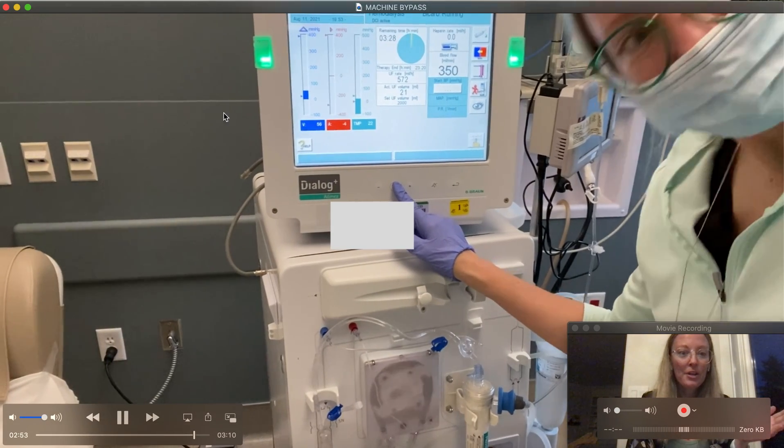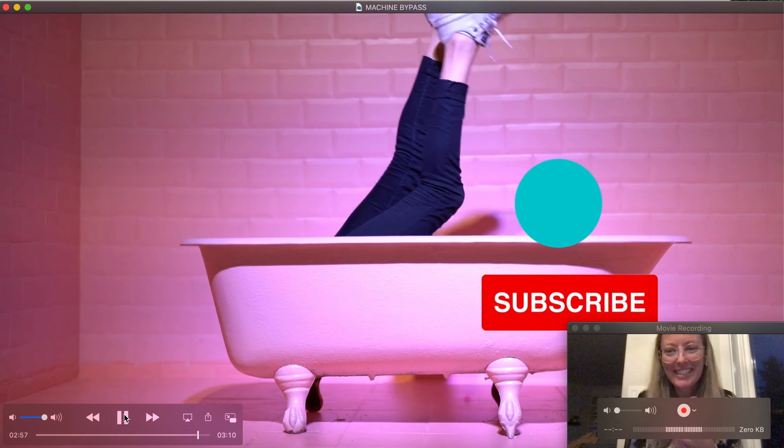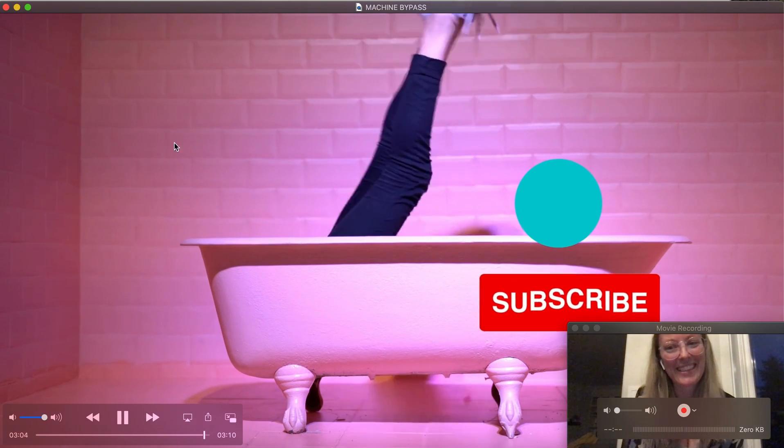And that is how you put the machine in and out of bypass. Thank you everyone for watching and stay tuned — I am also doing a video on dialyzer reprime. Thank you.